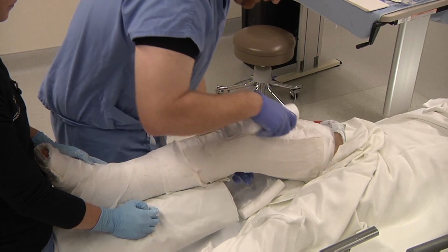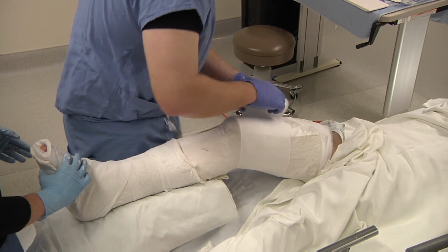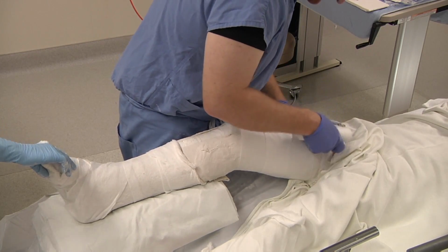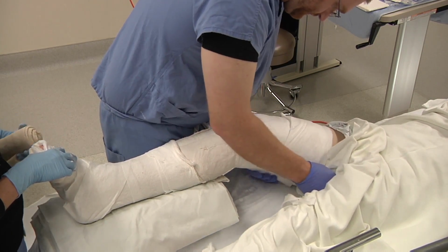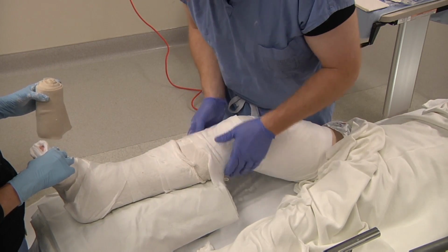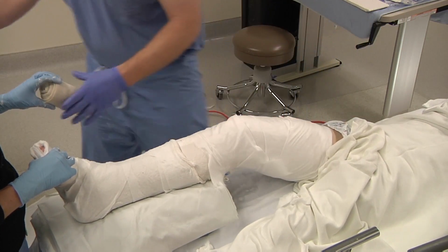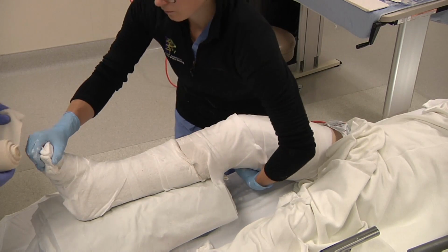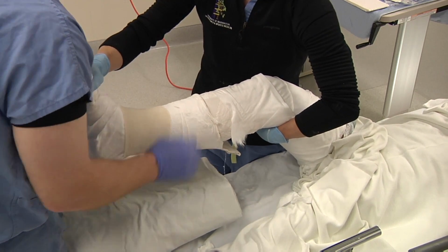Next, extend it higher. Trying to cover really as much as we can. Then you'll have your assistant move back up. Lift the leg. Apply your bias overwrap.